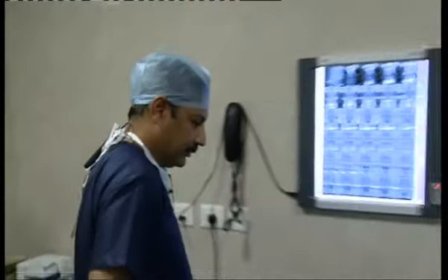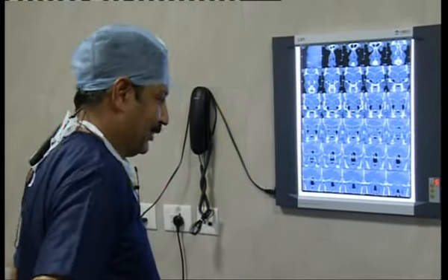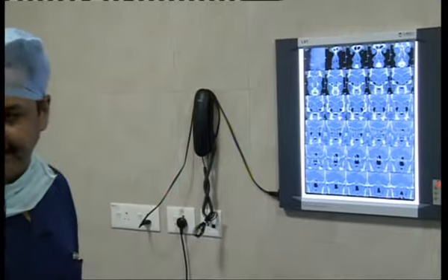Welcome me. Yeah. But until the patient is getting ready for the surgery, please do the CT. The moment the patient is ready for surgery, please stop the CT. Both ways. Okay. Okay. Yeah.